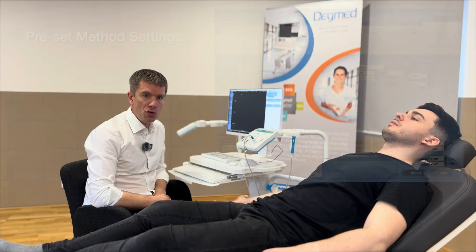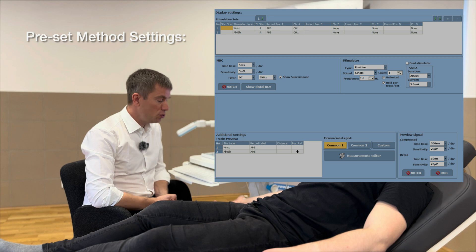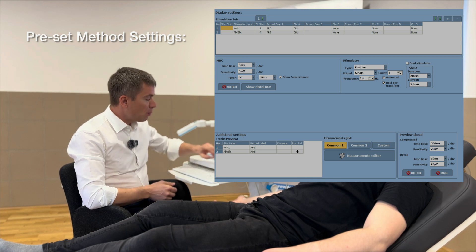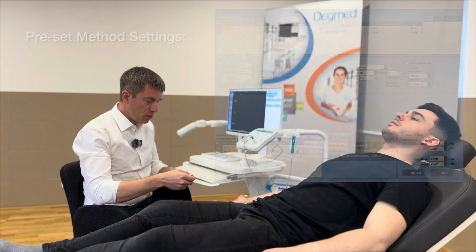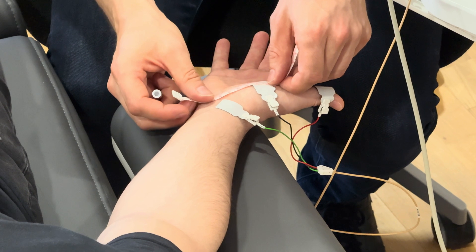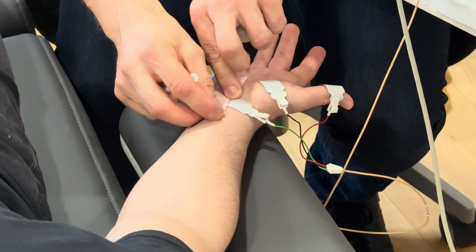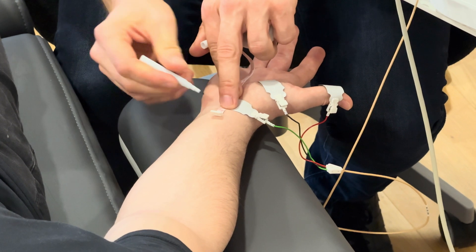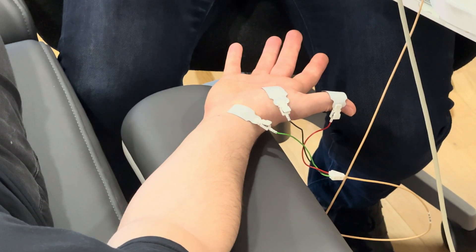To compare our results with reference values — whatever reference values you want to use in your daily practice — we need to be sure that the right distances are measured. For distal stimulation of the median nerve, we use a distance of around 7 cm between the stimulator and the recording electrode. I put a marker over here at the wrist.